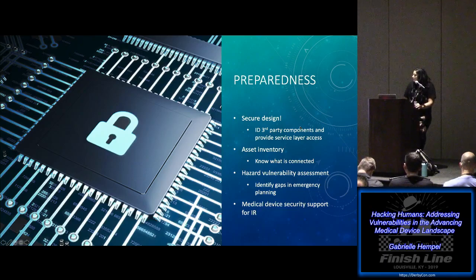The first phase MITRE wants us to consider is preparedness. Secure design of medical devices in question is a huge concern, especially identifying and securing any third-party components that might be part of the device, and providing service layer access during an incident in order to ensure minimal disruption of clinical ops and a more rapid response. Doing an asset inventory and knowing what is connected to the network is also a big part of preparedness. By maintaining a baseline set of information about each medical device, organizations will better be able to account for and manage devices before, during, and after an incident.